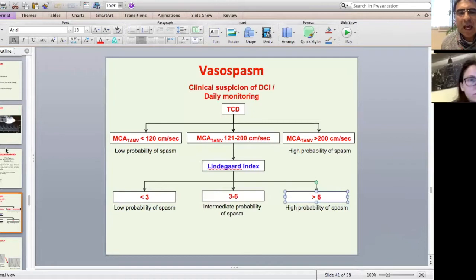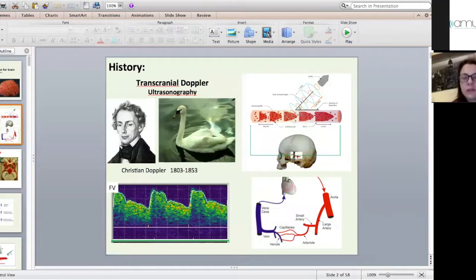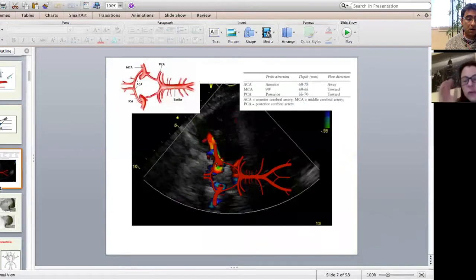It was very clear. Whether there is someone questioning about the transducer you use in transcranial Doppler, Chiara, could you please explain a little bit more about the different types or different kinds of transducer you use in order to perform the transcranial? You actually use a 2 megahertz probe, which is the probe that you use for the cardiac ultrasound. So nowadays, most of the ultrasound machines have a particular setting, which is called transcranial Doppler, and which optimizes the image of the brain. So when I was telling you that there are actually two ways to do transcranial Doppler, one way, which is the simplest one, is just to use the cardiac probe.